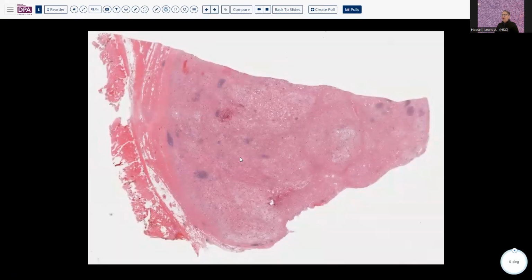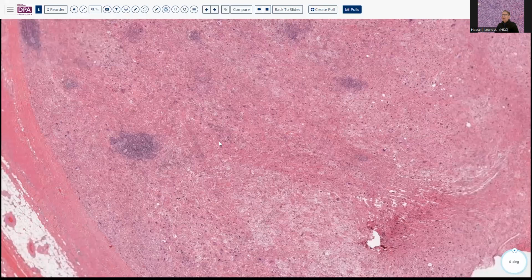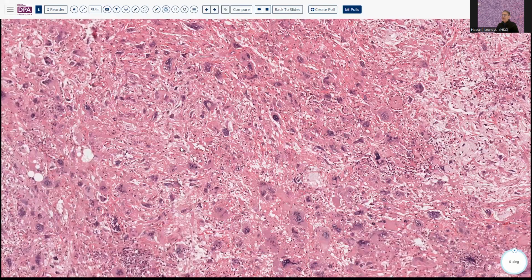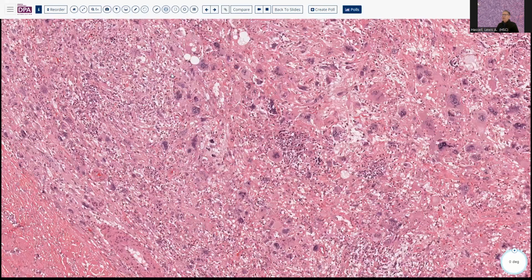One more example here, again in deep tissue, with skeletal muscle at one end. And you can see the occasional inflammatory component to this. This is a tumor which doesn't have quite as obvious a lipogenic component to it. It's very pleomorphic, and so you might be inclined to be thinking about undifferentiated pleomorphic sarcoma and so forth, but you should pick up on these clue cells.